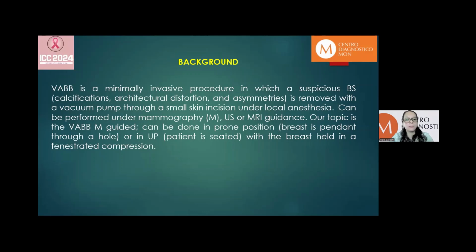Vacuum-assisted breast biopsy is a minimal invasive procedure in which a suspicious breast sample is removed with a vacuum pump through a small skin incision under local anesthesia. Our topic is mammography guiding in the upright position where the patient is seated.